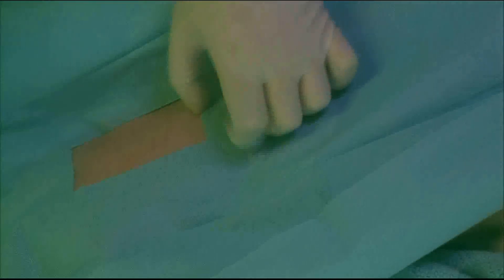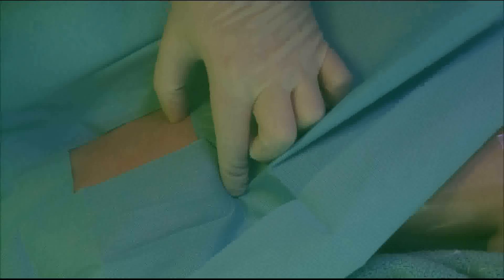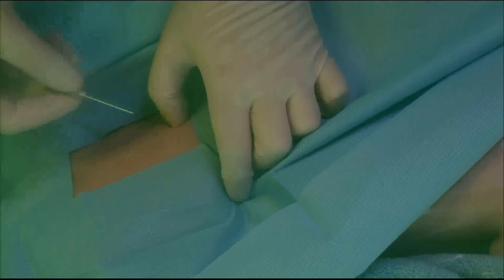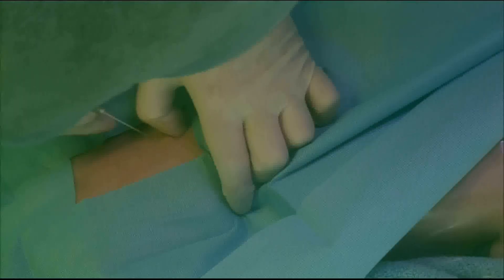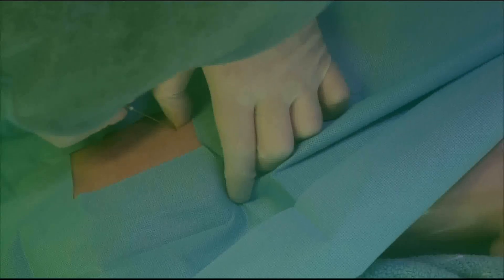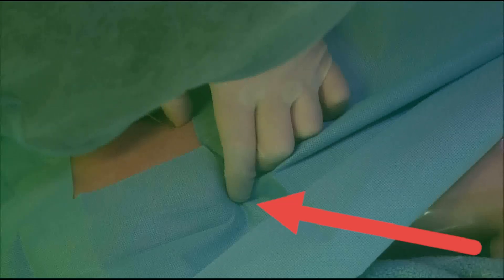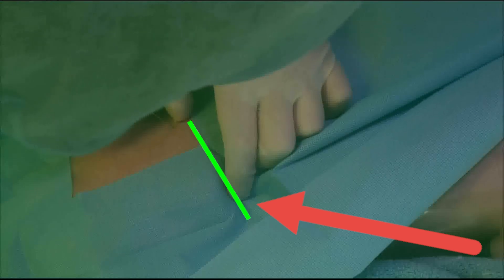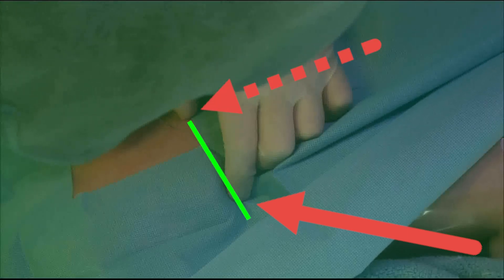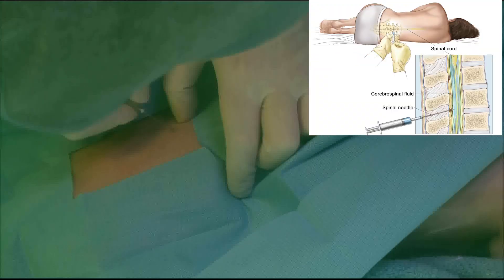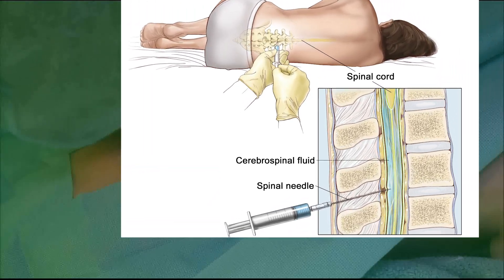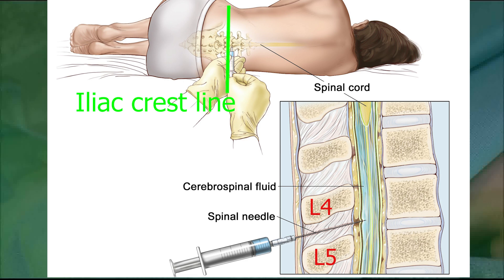The patient is initially positioned in a lateral decubitus position. Some surgeons prefer the prone position, but the technique is essentially the same. With my index finger, I am palpating the iliac crest, and along the same line with my thumb, I am palpating the spinous process of what is believed to be L4. My needle is going in between the spinous processes of L4 and L5, in that soft space between them — just the same way a lumbar puncture is performed.